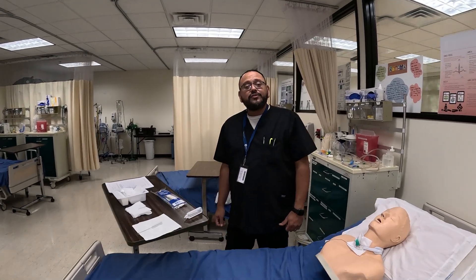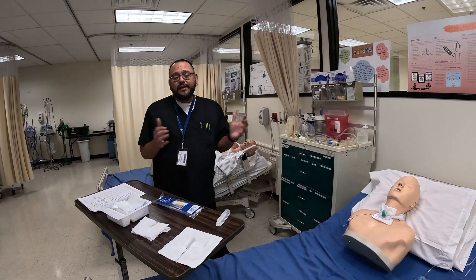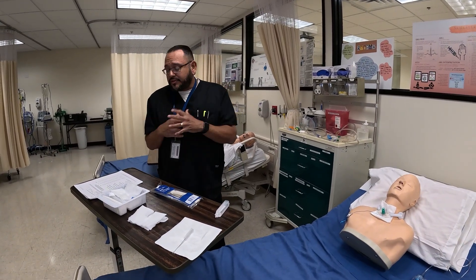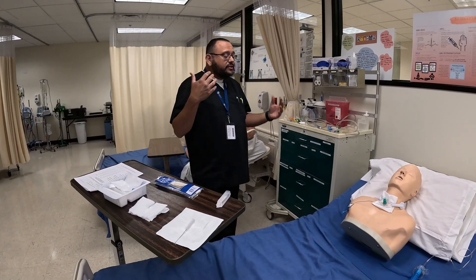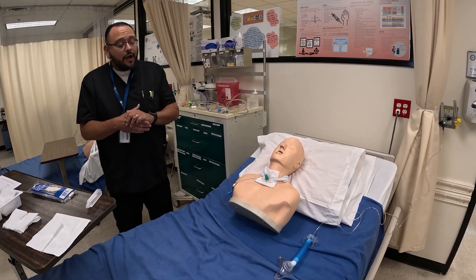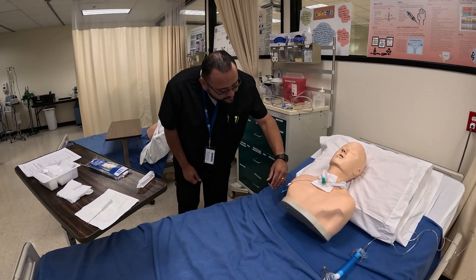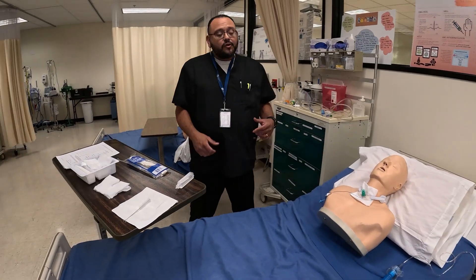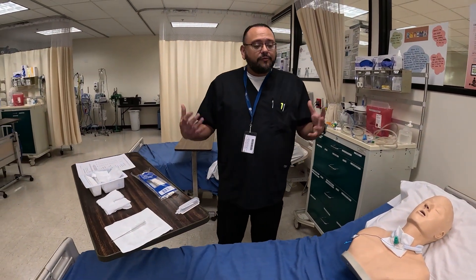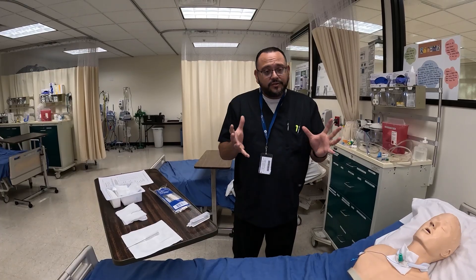Hi, welcome. I'm Harvey Olivia, clinical instructor with the Respiratory Department. We are going to do our competency for tracheostomy care. Like we always start these videos, the most important thing is to verify your orders and check the patient's chart. Introduce yourself to the patient: 'Hi Mr. Smith, my name is Harvey, I'm with respiratory, I'm just gonna do some trache care for you.' Make sure you identify the patient — check the armband and date of birth. Also have your PPE on; for this video demonstration we'll pretend we have it on.